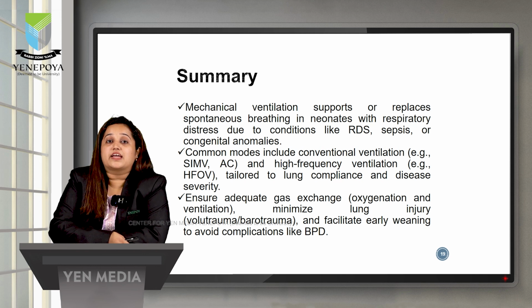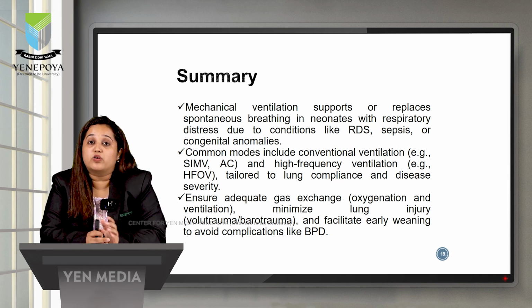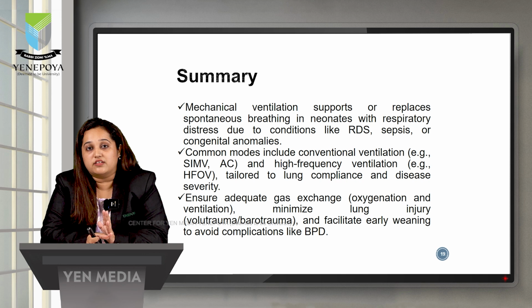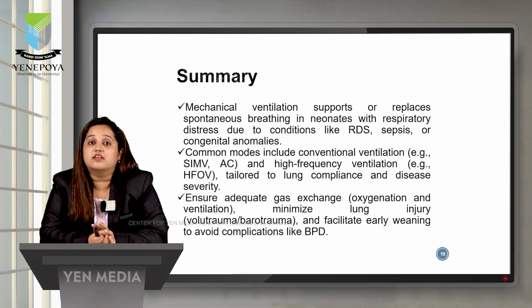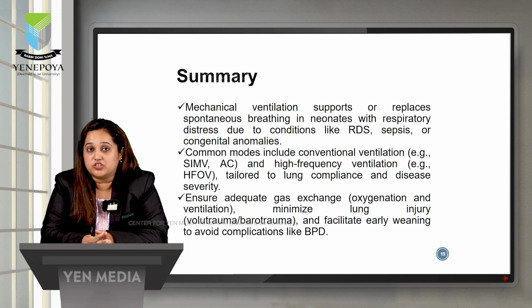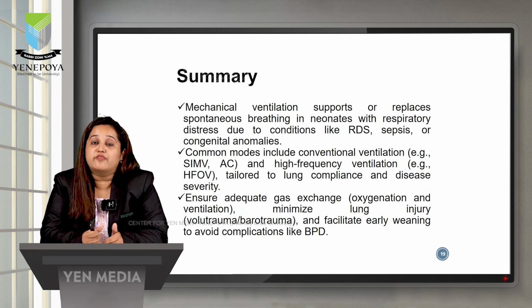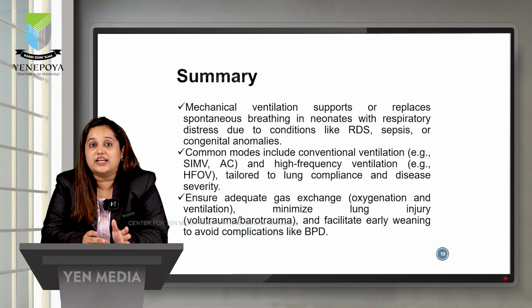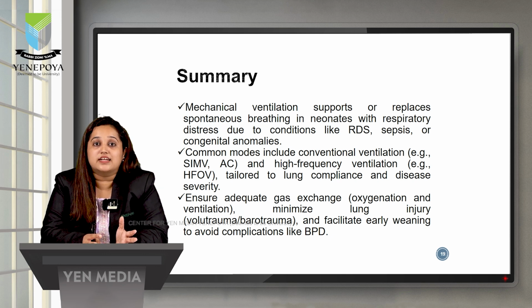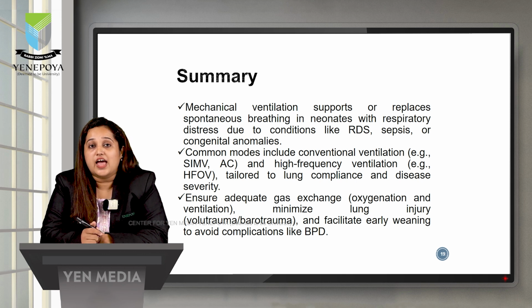To summarize, mechanical ventilation supports or replaces spontaneous breathing in neonates with respiratory distress due to conditions like respiratory distress syndrome, sepsis, or any congenital anomalies. The common modes of ventilation, like I told, include SIMV, patient triggered ventilation, and pressure support mode of ventilation. Also high frequency ventilation, which is an advanced modality to maintain the oxygenation and ventilation. These are the modes that are used to tailor to the lung compliance and the disease that the baby is having. Ensure adequate gas exchange, that is the oxygenation and ventilation.